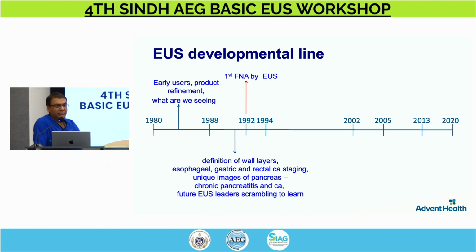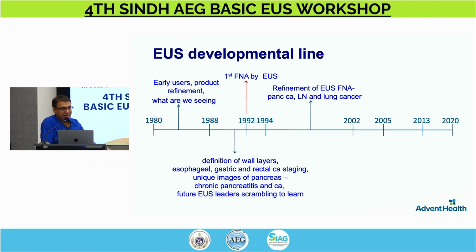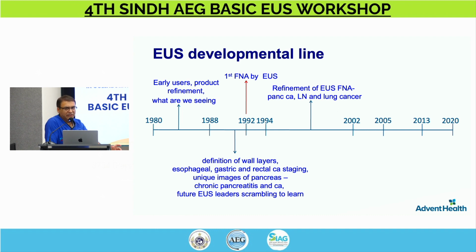Dr. Peter Vilmann did it, he still practices, I think. It was a FNA of a mediastinal mass, lymph node, actually. So that's when it was.